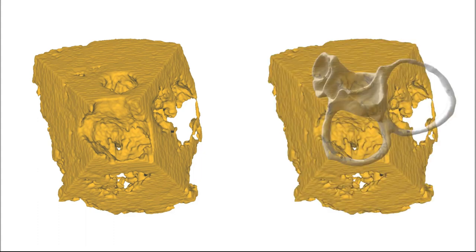Once you get comfortable doing this, whenever you get your 3D data set, and if your probe happens to move and you lose your mitral valve, you don't have to go back to 2D to come back. You can actually figure out which way you need to turn the probe to get the rest of your mitral valve back while it's still in 3D, which will really speed you up in the OR in the 5 minutes you have to get a full study done.